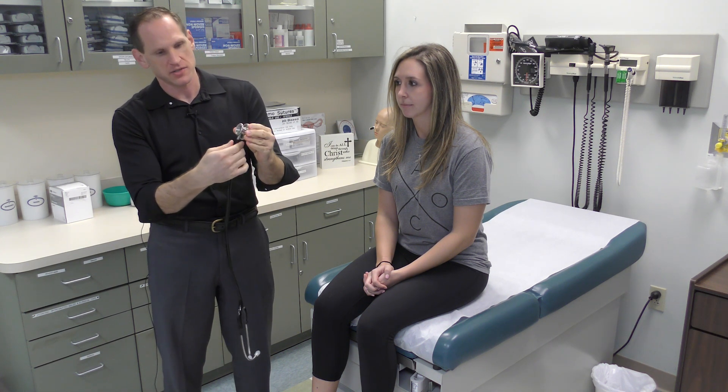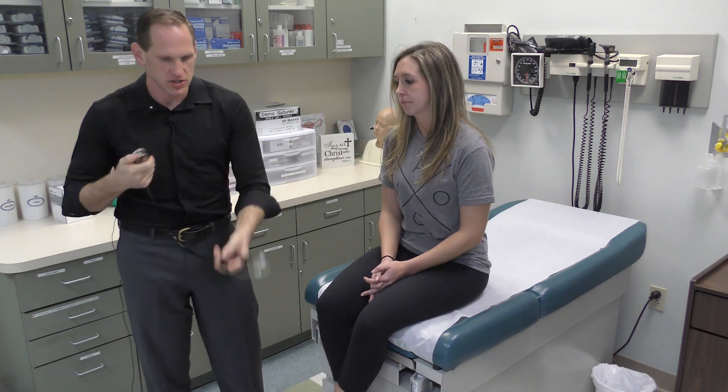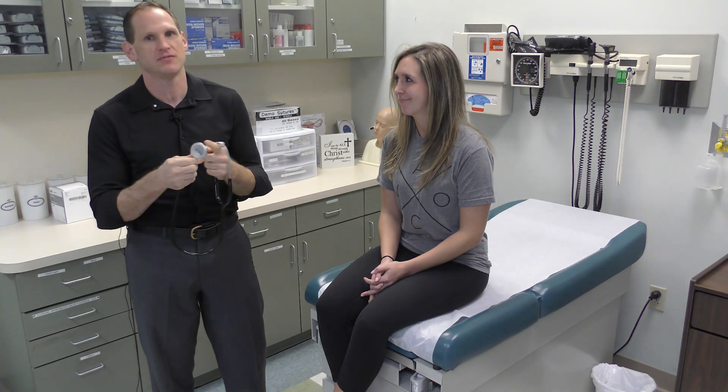Most stethoscopes will have two sides. This is called the diaphragm, and this is called the bell. The diaphragm is used for higher-pitched, louder sounds. The bell is used for lower-pitched, softer sounds, and it'll be able to twist. When it twists, there's a little hole — whichever direction that hole is facing is the side that's going to be active. Before you start listening, gently tap or visually check which side the hole is facing. Nothing more embarrassing than listening for 30 seconds and realizing you're not hearing anything because you've got it the wrong side.